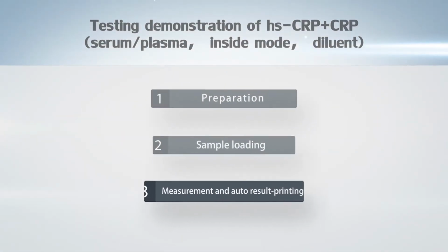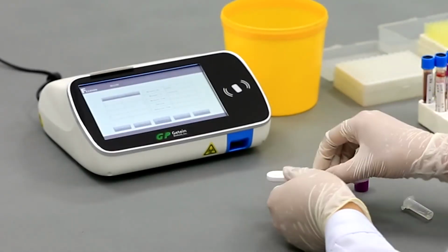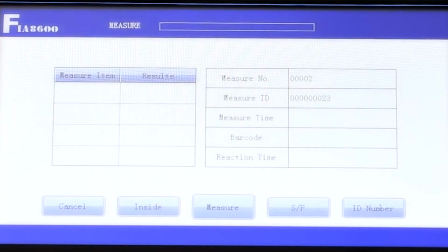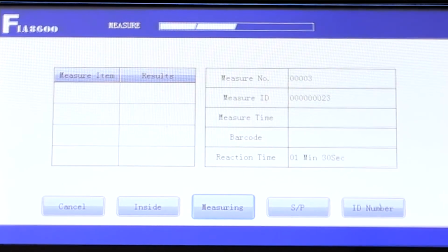Step 3. Measurement and auto result printing. Insert the sample card into the test port with the arrow side inward. On hearing the click sound, check panel and sample mode. Then press Measure to start testing process.